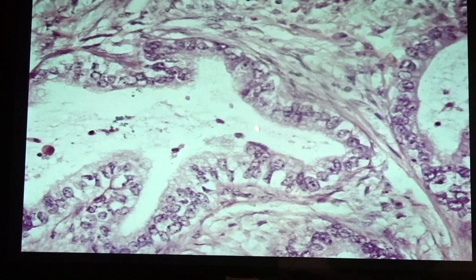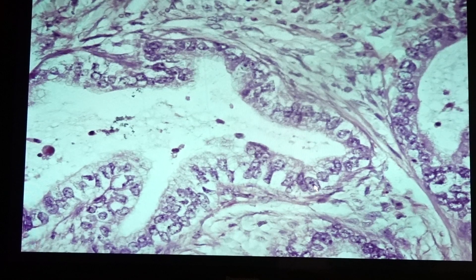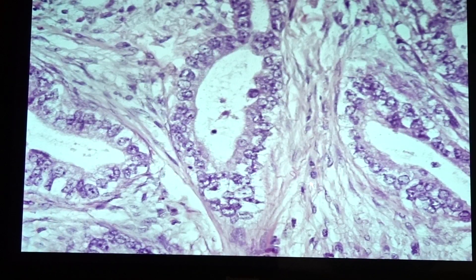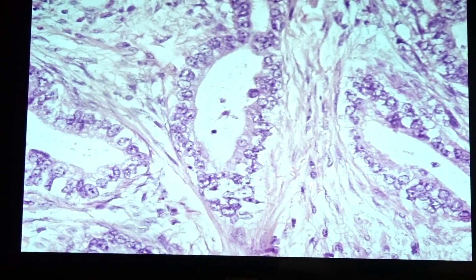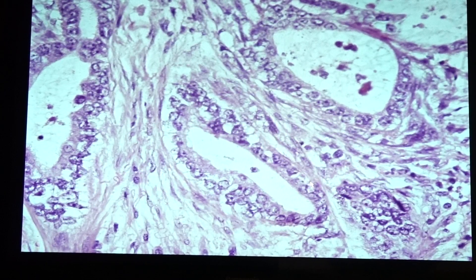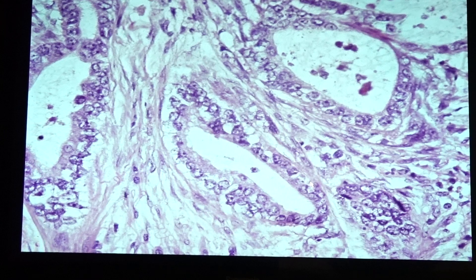You can see the cells displaying pleomorphism and prominence of the nucleoli, and they are seen infiltrating into the stroma. Next we have the hepatocellular carcinoma slides.